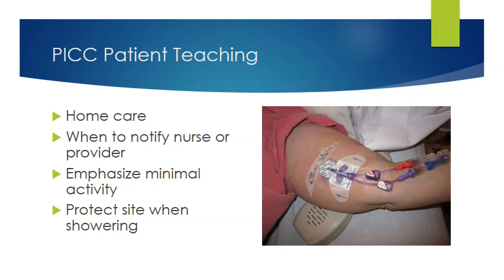We need to teach them when to notify the nurse or the provider or physician or whoever it is that they have to contact. We want to make sure that we emphasize with them that they have minimal activity with that arm. Again, we're looking at dislodgement here. And then also to protect the site when showering. And those of you who have seen IVs and patients who have them when they shower, you know that we wrap them because we don't want water pouring down on those sites. But they actually can bathe. We just have to protect that site and wrap it up.